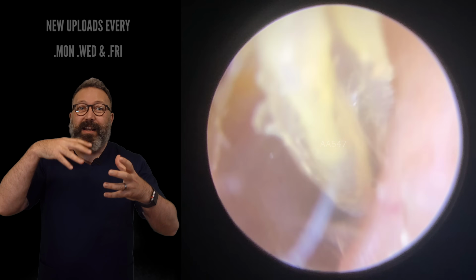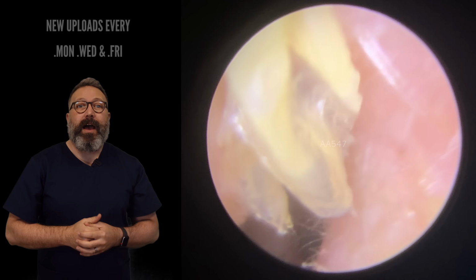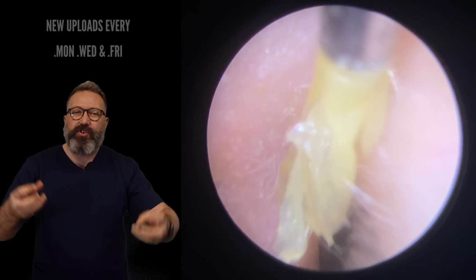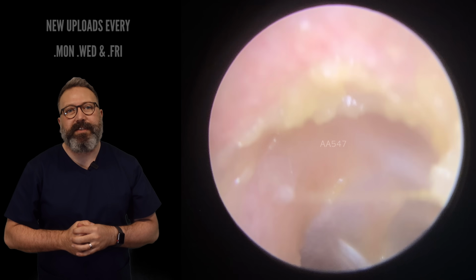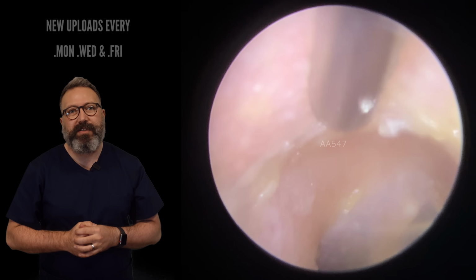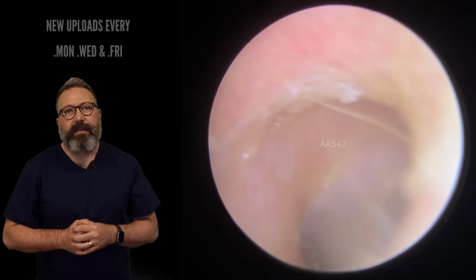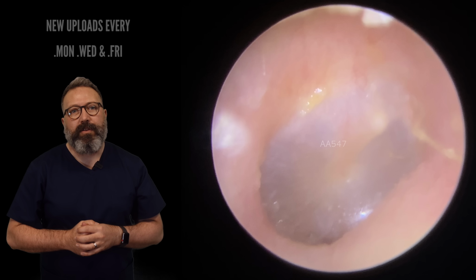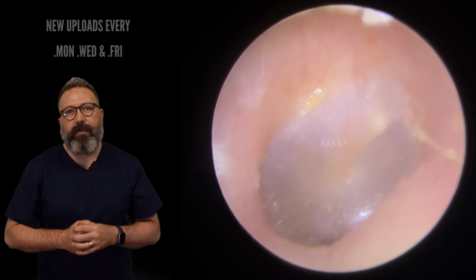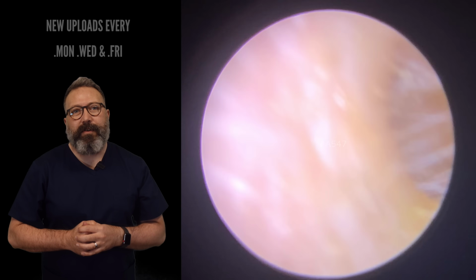Look how all this is kind of concertinaed up in there, and you pull out these longer strips of skin there, and we'll just tidy up this top little section. You can see that's where it started to detach there. So let's get all these little bits away. There we go. We'll take a look at that eardrum. Looking very healthy there, all looking very good. So we're going to take a look now in the patient's other ear.